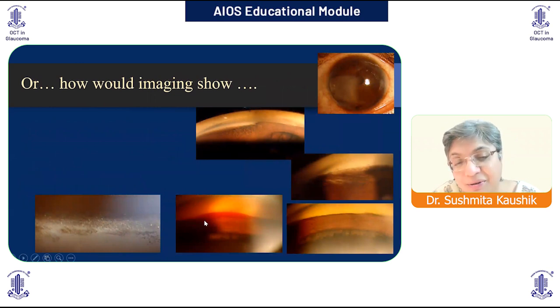Silicone oil. This is neovascular glaucoma with blood in the angle. These are the nodules of Cogan-Reese in ICE, and this is essential iris atrophy. This is the angle closure due to NVG. So this is the same patient after an anti-VEGF, and you can see the ciliary processes underneath this, which shows that it's a pulling mechanism of angle closure. And this, of course, is Chandler's with a little bit of corneal edema there.